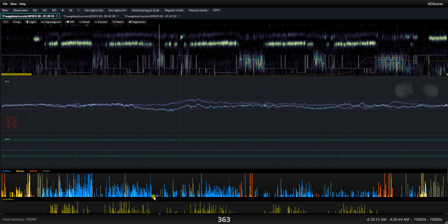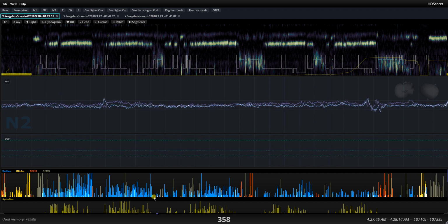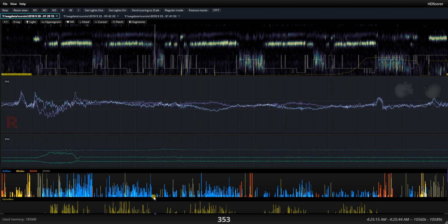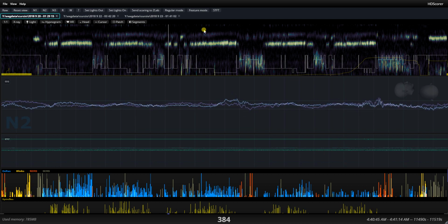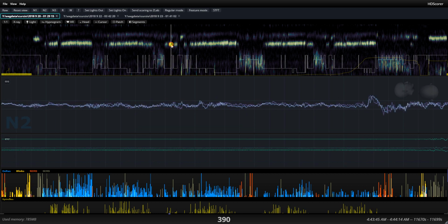Then what I would want to see is this gap, analyze this gap, which, yeah, okay, that's not REM. Wake, REM here as well. Okay, so this, I would say pass. If we want to be very precise, there's a gap here in the spindles, but then there's K complexes in between, so that's fine that this is a straight N2 line right there.